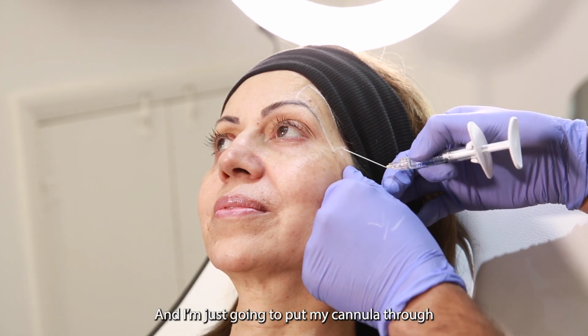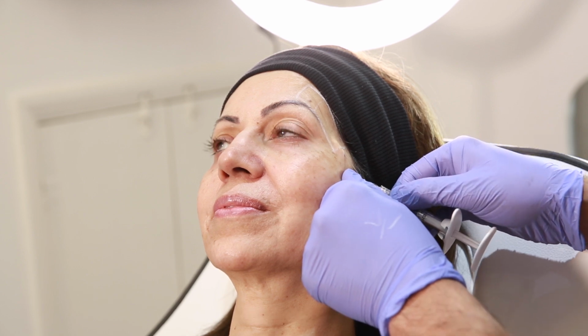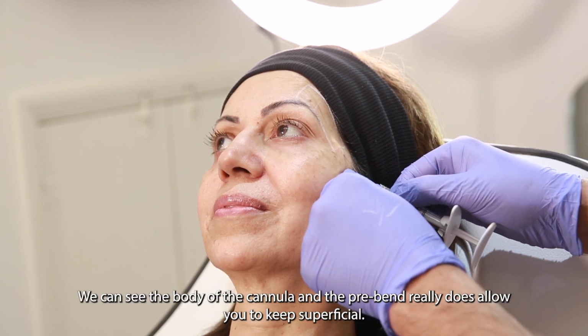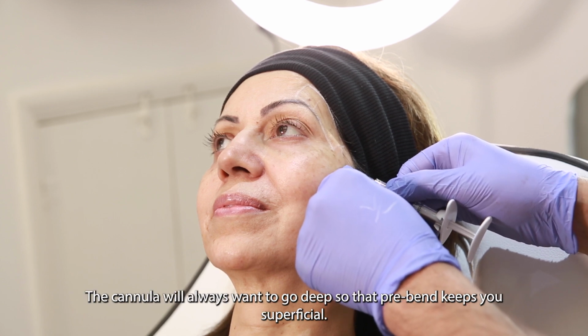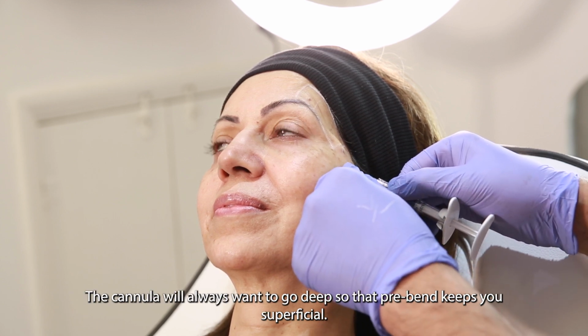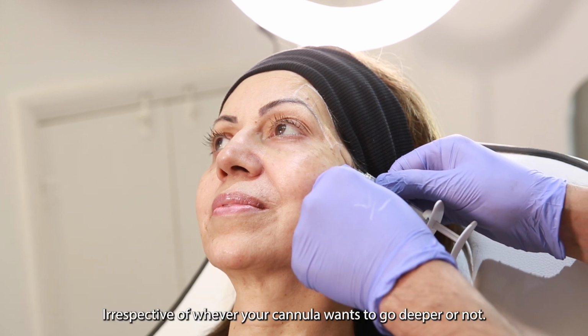I'm just going to pop the cannula through. Nice and superficial. You can see the body of the cannula, and the pre-bend really does allow you to keep superficial. Your cannula will always want to go deep, so that pre-bend keeps you superficial irrespective of whether your cannula wants to go deeper or not.